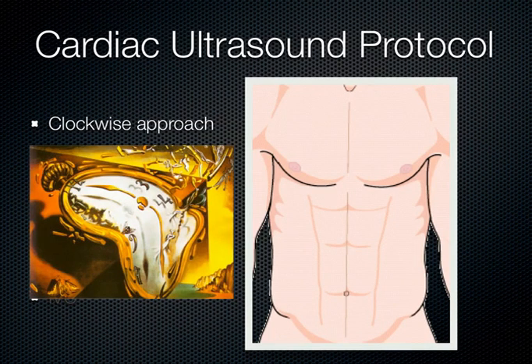So to conclude, it's sort of a clockwise approach when we're looking at the heart. That's kind of how I think to do it. I start up in that parasternal area. First, I kind of look over to the patient's left hip or left elbow to get the parasternal long axis, and then I aim the indicator over to the patient's right to get the parasternal short axis, and then I slide that transducer just below the left nipple with the indicator to the patient's right, and then I move it to the subxiphoid area with the indicator to the patient's right. So I start to the left, and then I move to the right, and it stays to the right, the indicator that is.